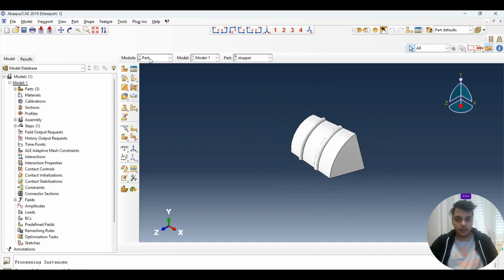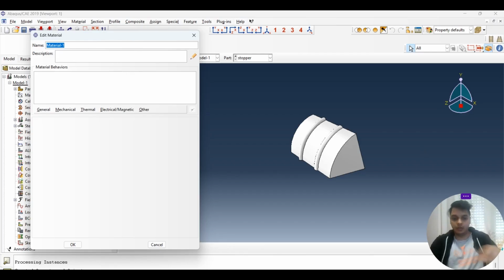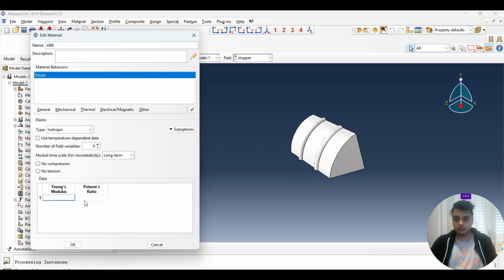Since the part is already defined, now we have to define the properties. Either you can check it from this tree section, this drop down, or you can select it from this module part. We initially define the barrel as ABS, and we'll check out the elastic properties for it. It's always between 1900 MPa and 2500 MPa. That's the Young's modulus. So let's take 2200 MPa as the Young's modulus. Poisson's ratio is 0.3.